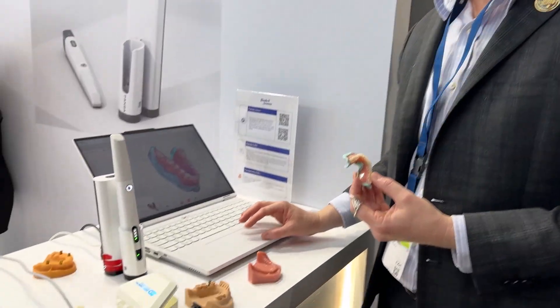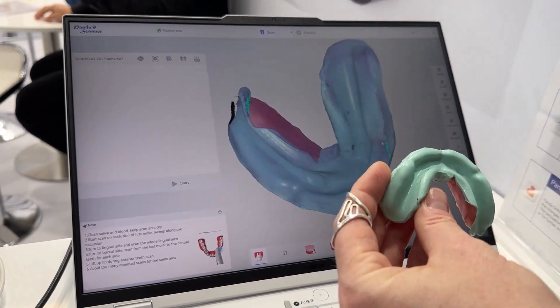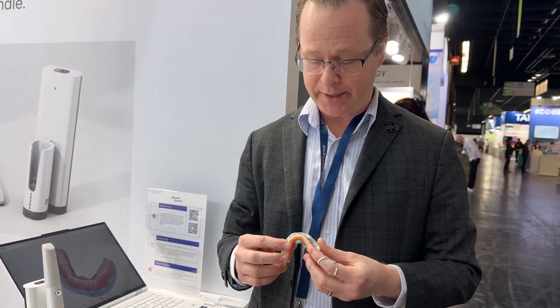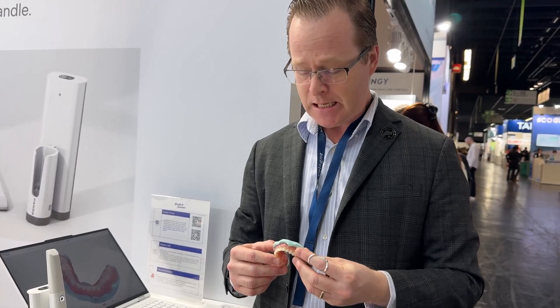Let's take a look at the scan. Well, that was the end of our denture 360 scanning here with the Panda 6 wireless scanner — very impressive, very clean, very easy. This is Dr. Michael Scheer here at IDS checking out some of the newer intraoral scanners here in Cologne, Germany. Let's go check out some other scanners.